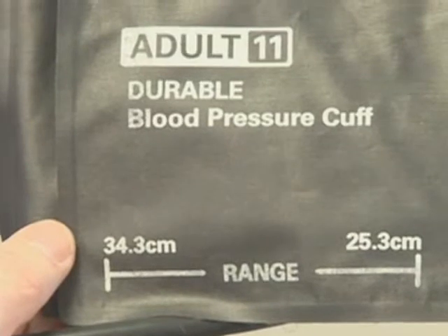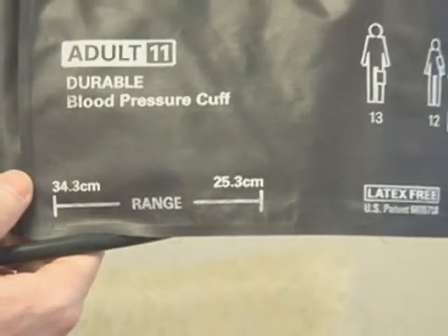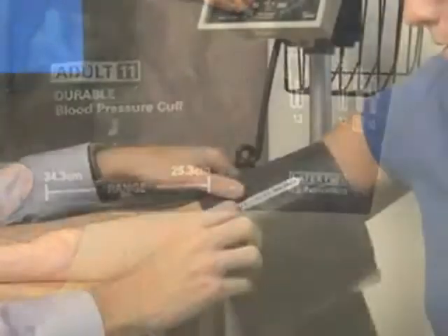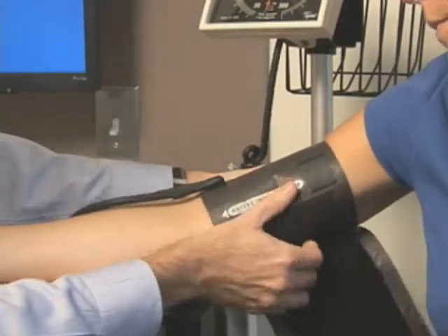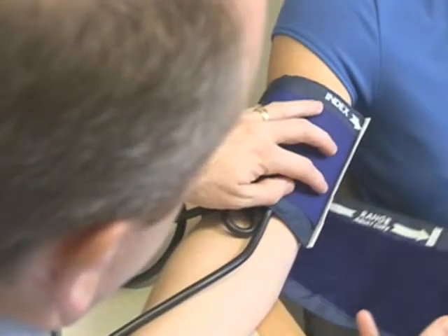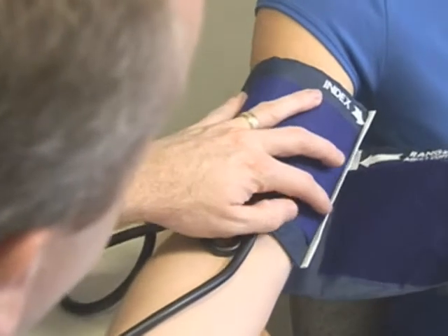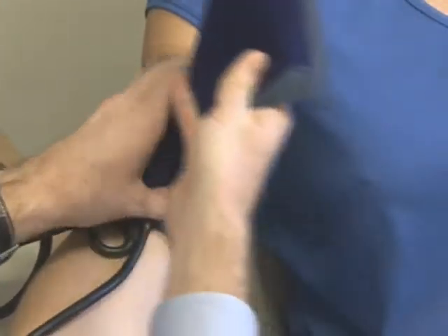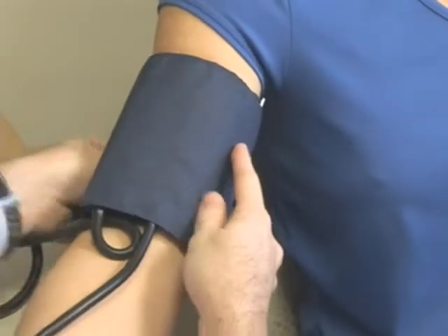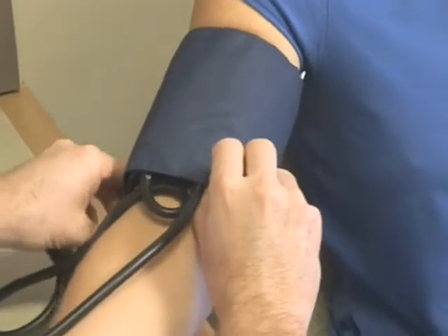Cuffs typically are marked with acceptable sizing indicators to facilitate proper fitting. However, it is more important to use a cuff that is appropriately sized for the arm. To assist in selecting the appropriate size, cuffs should be marked with an index line that runs perpendicular to the length of the cuff and a range line that runs parallel to the length of the cuff. The index line should fall within the range line when the cuff is secured to the upper arm.